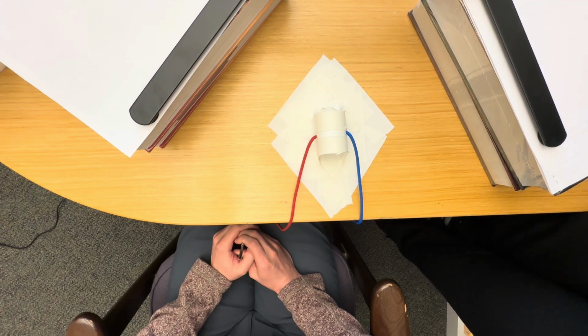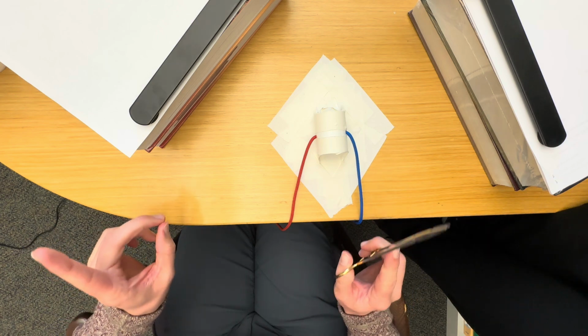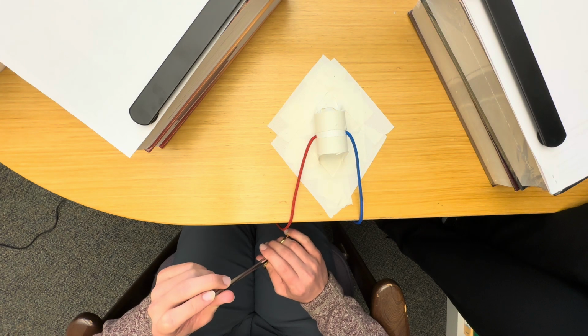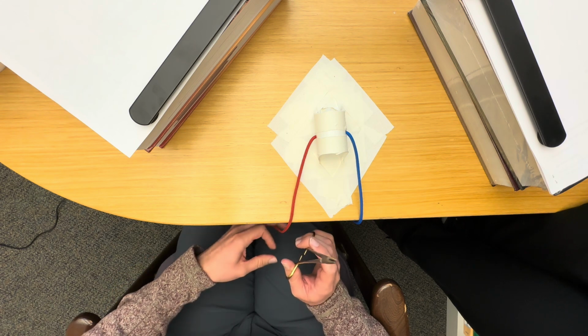All right, so we just talked about the two-handed tie. The next one we're going to talk about is the one-handed tie, and we'll talk about both tying with your left and your right hand. This is more common when you're doing a perineal repair. It's just a little bit easier to do one-handed due to the space that you have compared to the two-handed.